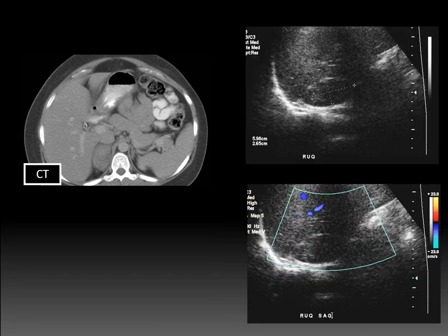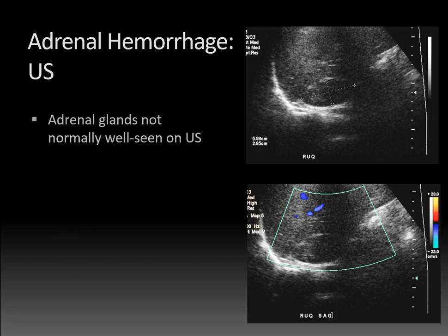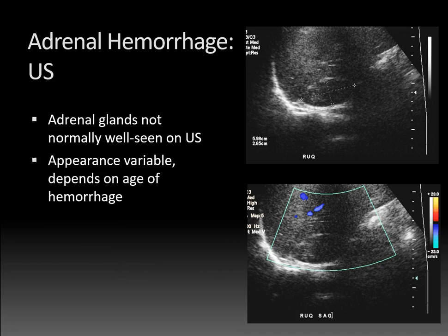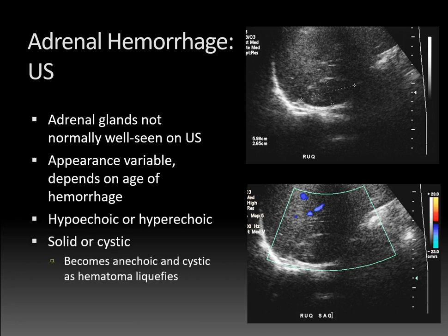What about ultrasound for adrenal hemorrhage? This patient had a right upper quadrant ultrasound prior to the CT scan, and you can see there's a six-centimeter ovoid well-circumscribed solid-appearing mass in the region of the right adrenal gland. On the lower image showing color Doppler, there's no flow within the lesion, so it's avascular. On ultrasound, adrenal hemorrhage appearance is variable depending on the age — it could be hypoechoic or hyperechoic, solid or cystic. Hemorrhage will become anechoic and cystic as the hematoma liquefies.